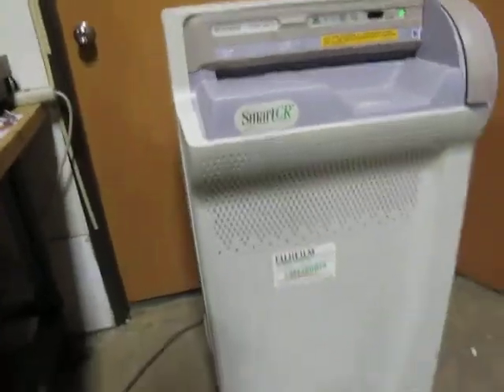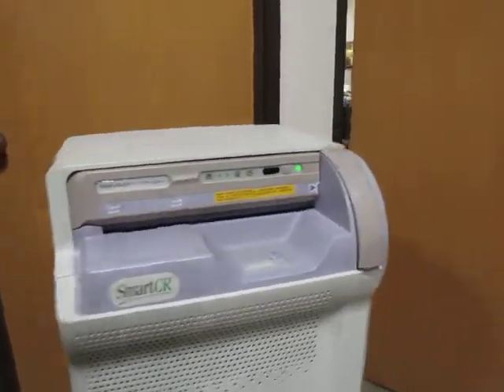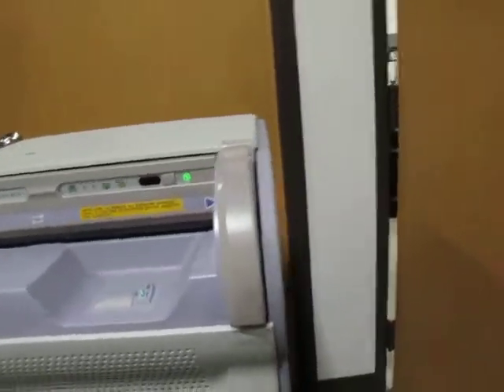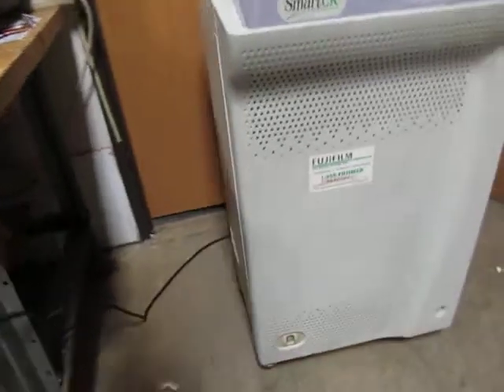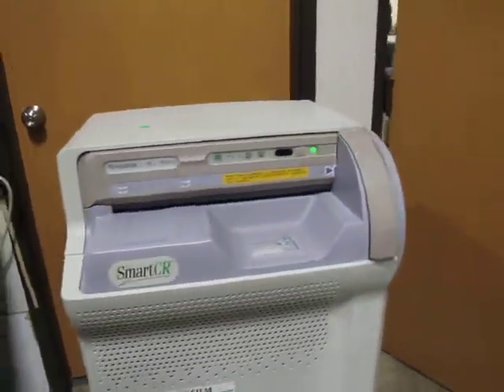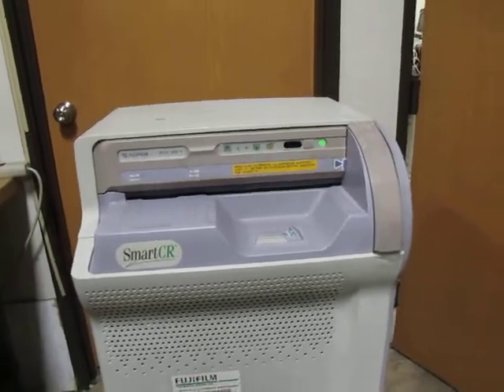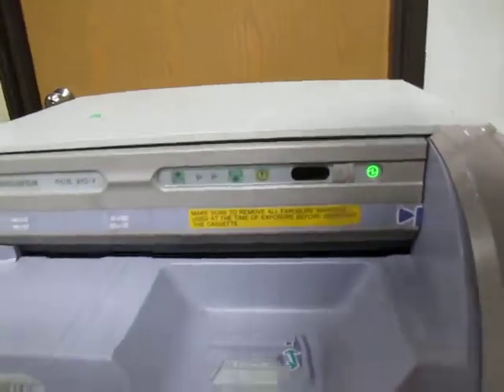We were told it's functional. I have no way to test it other than what you just saw. This piece looks like it was taped down, but other than that the unit looks fine. It seems to power up — no red lights, nothing else. If it was broken, I would think this warning light maybe, but I don't know.